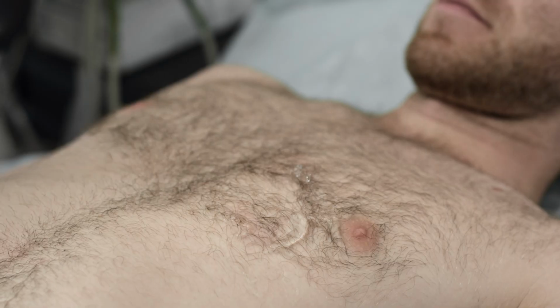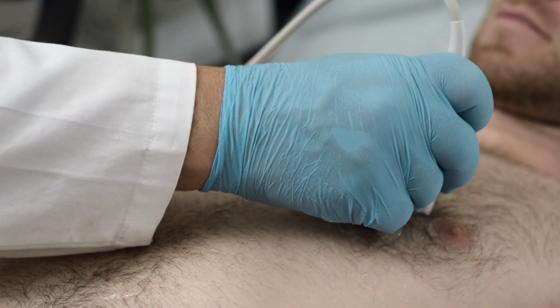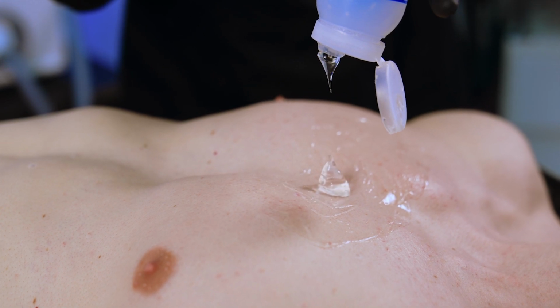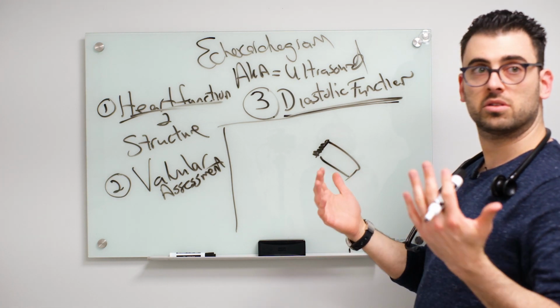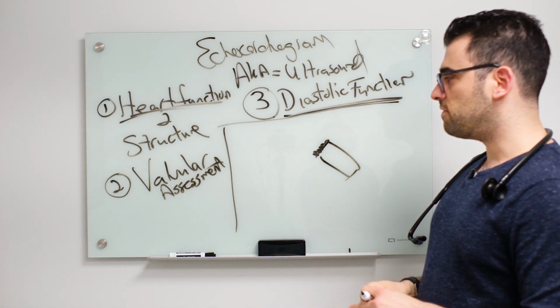With regards to what the patient should expect, it's not an invasive procedure. It usually includes an ultrasound machine, which essentially is just a probe where the sound comes out of, that gets put on the chest, and then we use conductive jelly that allows the sound to be pushed from the actual probe to the heart. So aside from a little bit of gel, there's no needles, there's nothing painful, a little bit of pressure on the site from when we need to push, but very well tolerated.